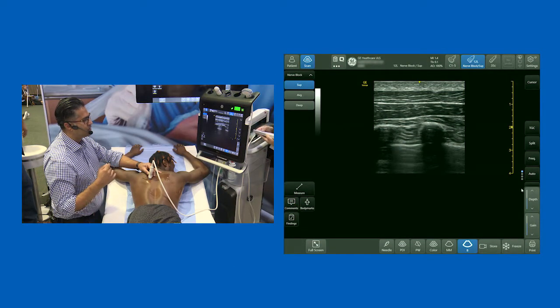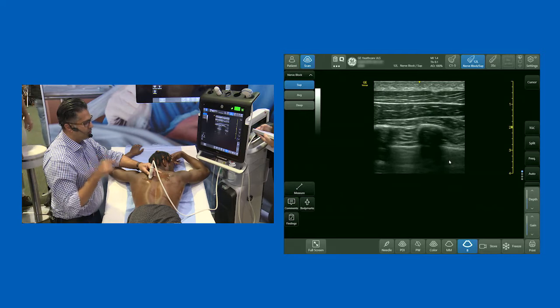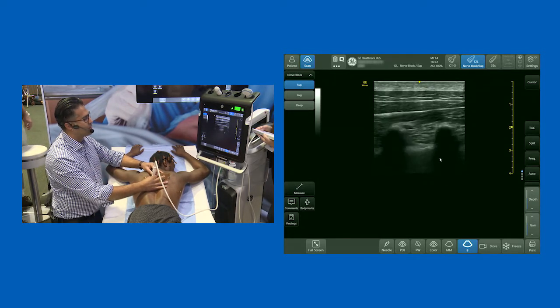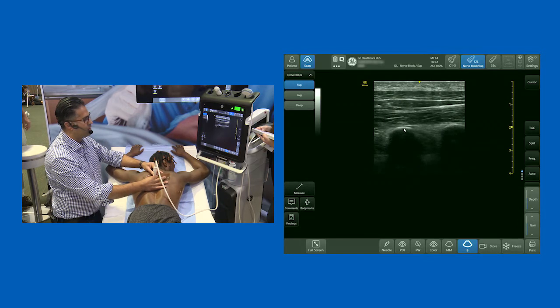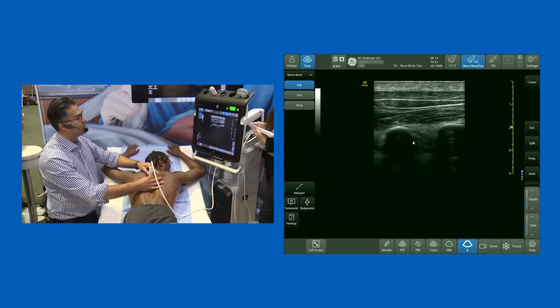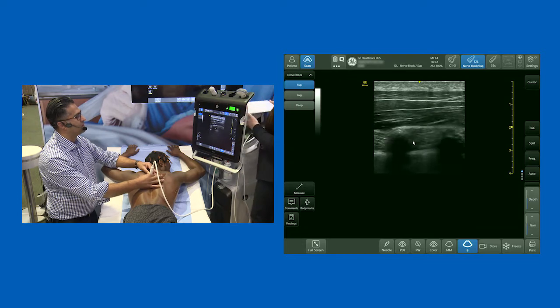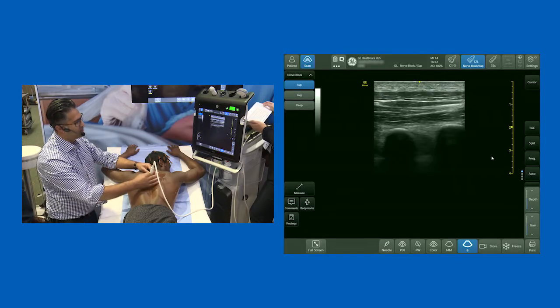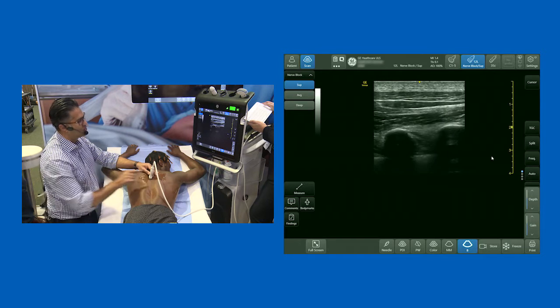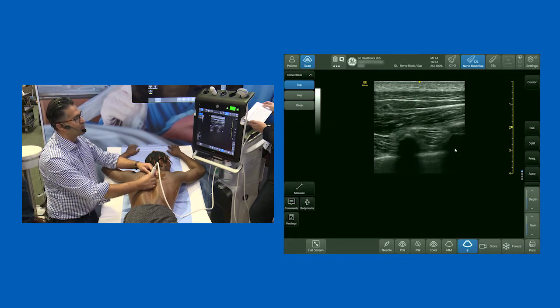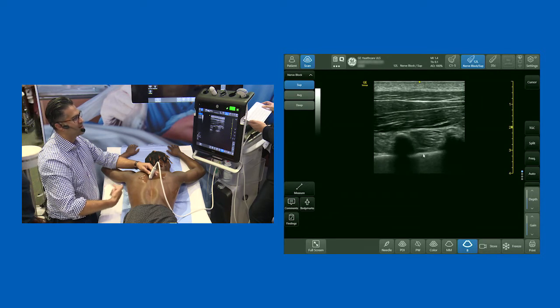Starting with the standard view as if going for an ESP block, but over the ribs. Moving towards the midline, you can see the ribs coming down. We're now over the transverse processes, but I want to see the superior costo-transverse ligament. So I'm going to tilt my probe slightly laterally — the probe is in a parasagittal orientation. Scanning from lateral towards medial, I've reached the transverse processes and I'm tilting the beam laterally. You can see a beautiful view of the pleura.